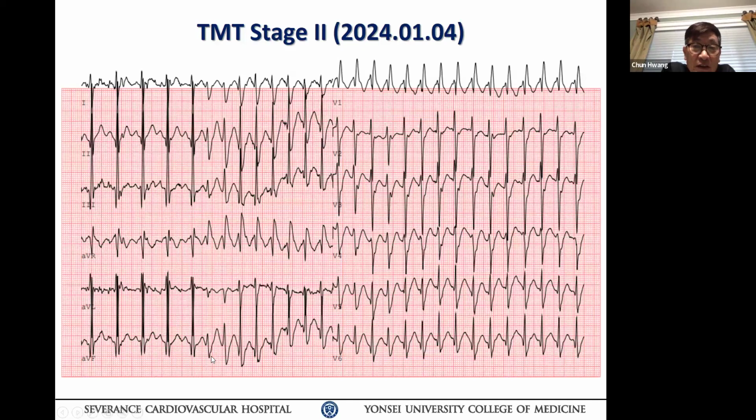So many fascicular VTs are initiated by a septal fascicular, or near septal fascicular, PVC, I should say. There is a proposed mechanism by the San Francisco group at the last meeting. They're proposing that maybe the trigger focus is between the septal and posterior fascicle. That way, depending on which is the orthodromic circuit, whether septal or posterior fascicle, the patient can present with both forms of tachycardia. That's what they're proposing right now, but nobody knows.